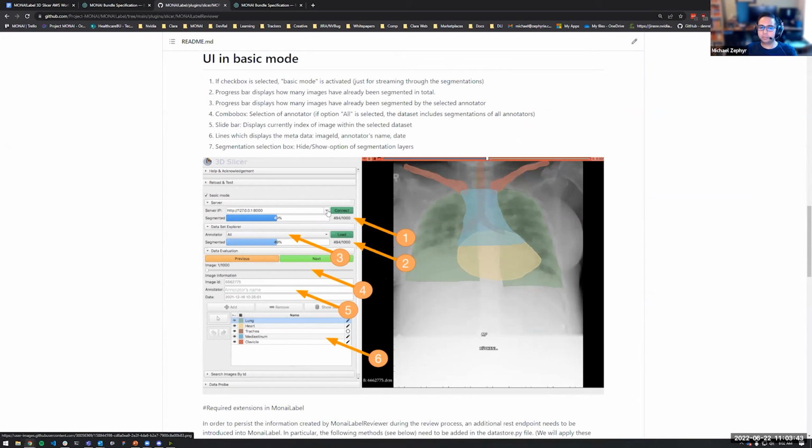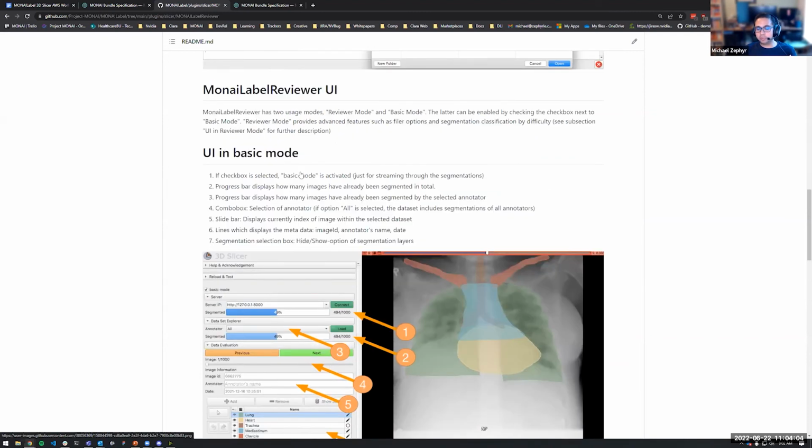So if you're working on something that's not a model, but an extension, modifying the extension, or you want to contribute directly to the extension and maybe it needs something, feel free to open up a discussion and let us know what you're thinking. We can work with you to integrate that into the project itself and highlight the work you're doing as part of your research.